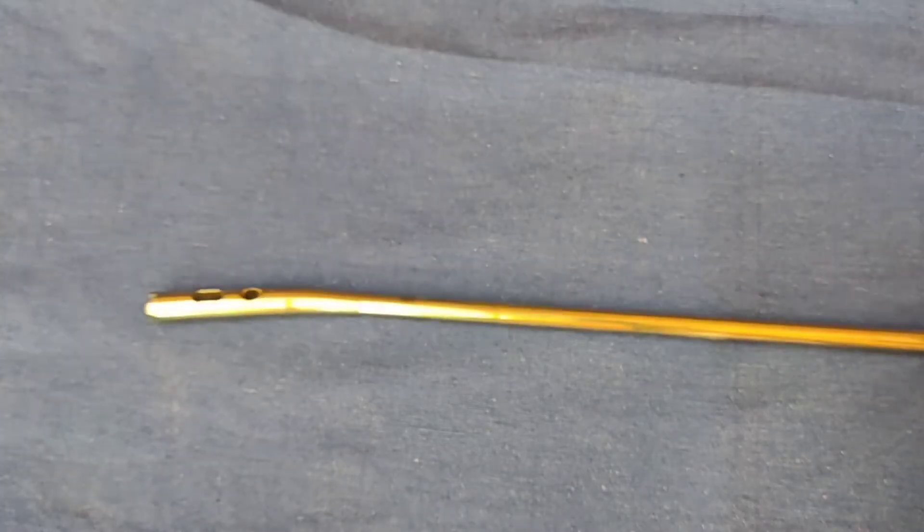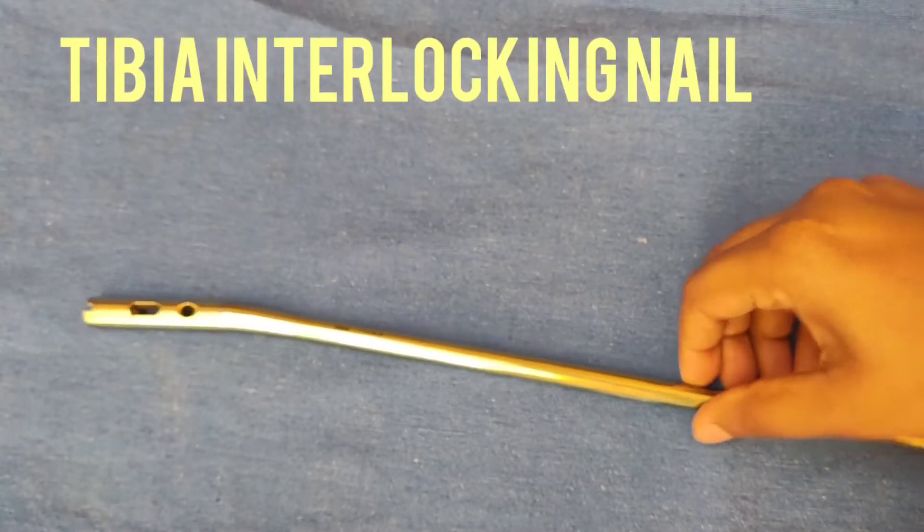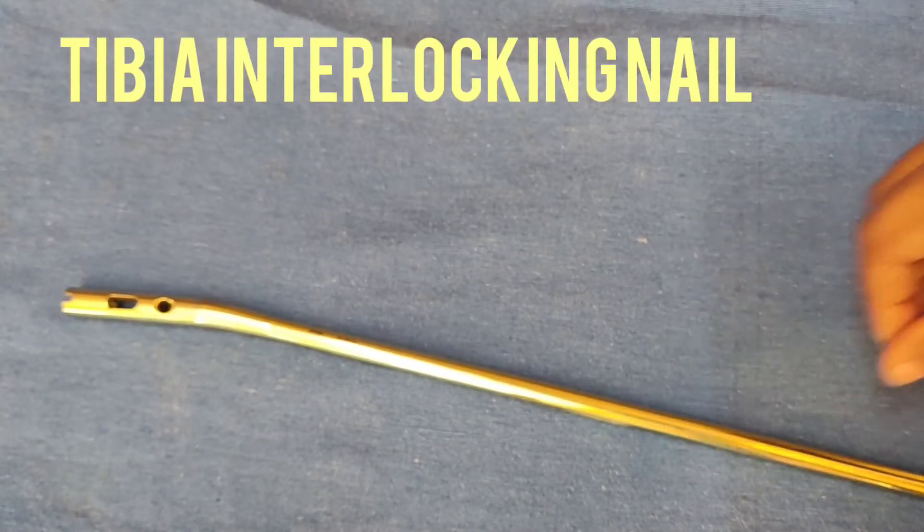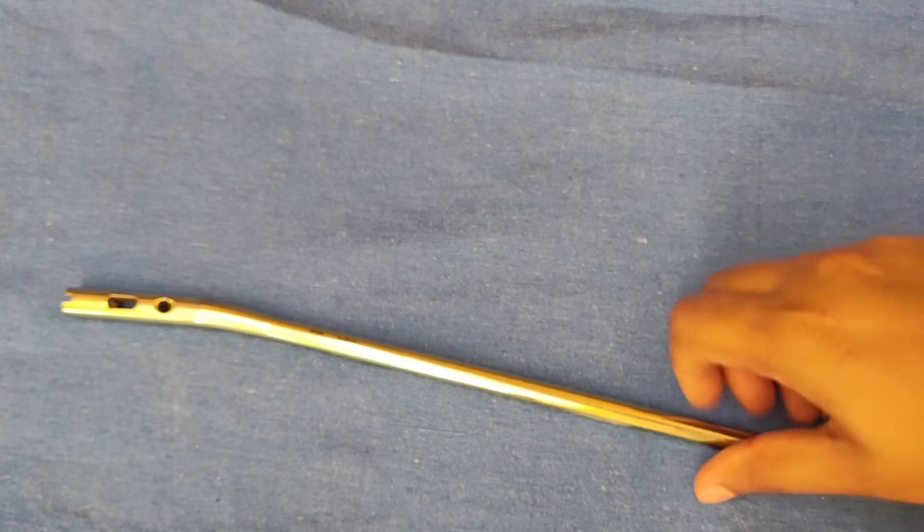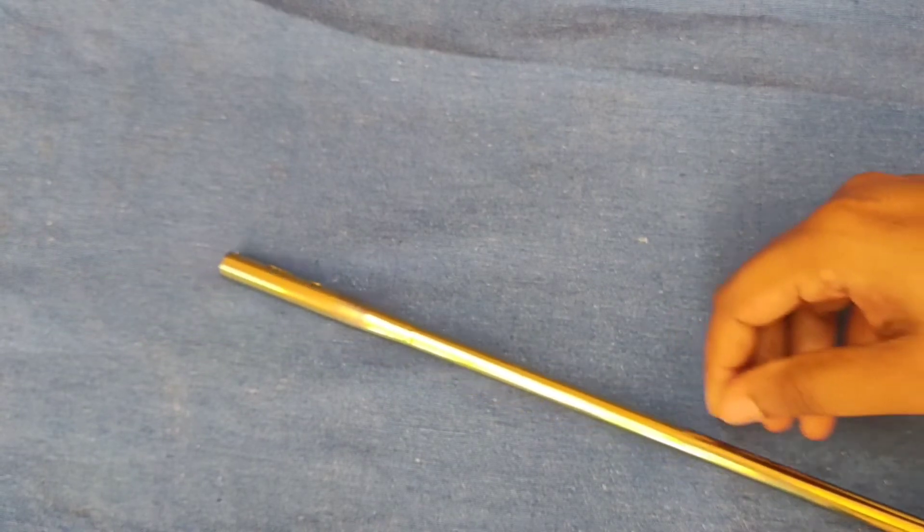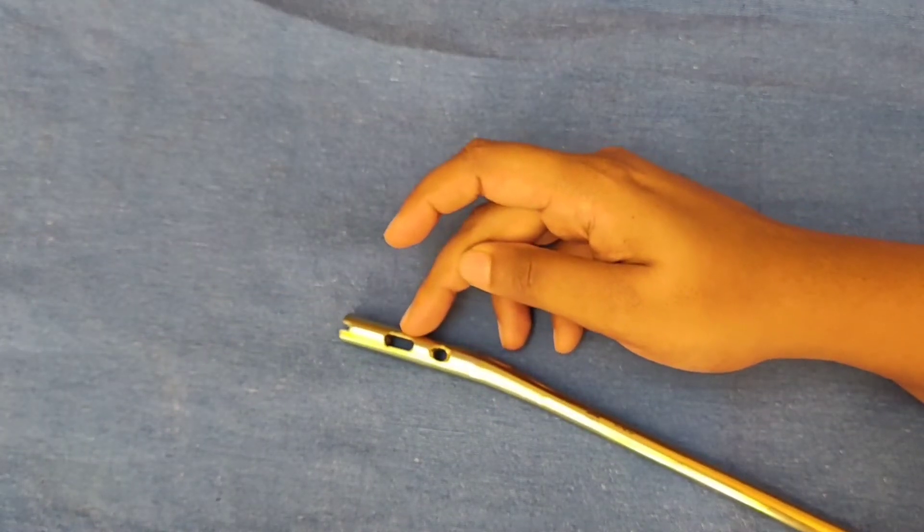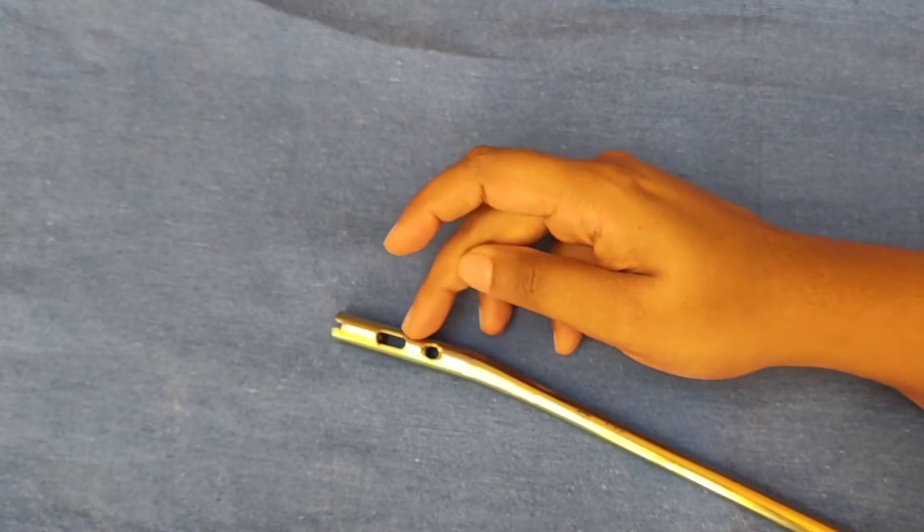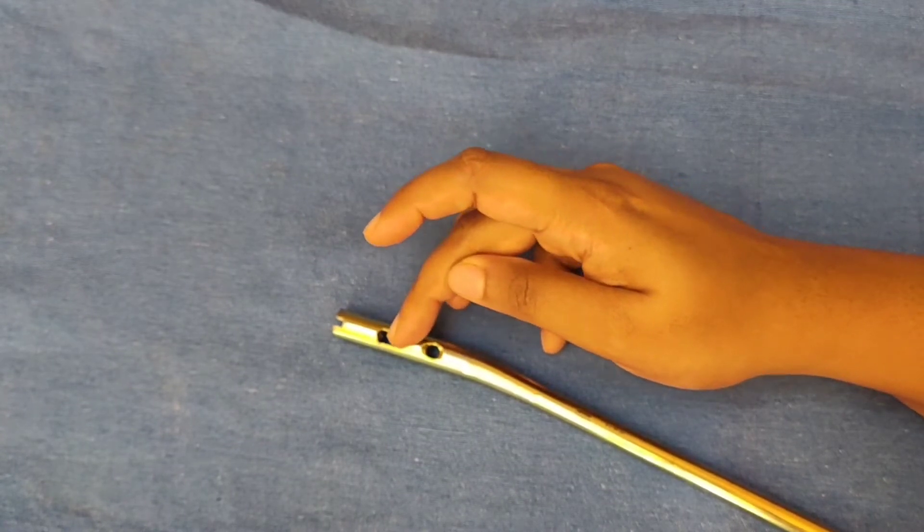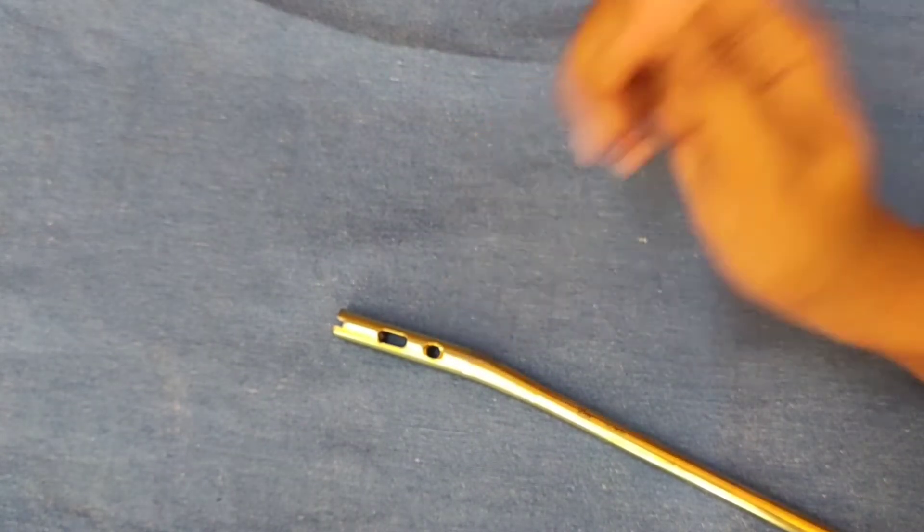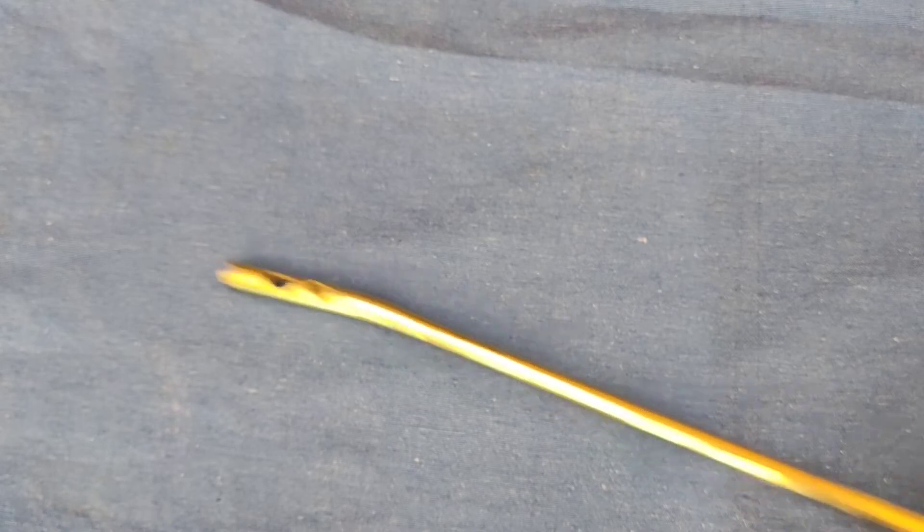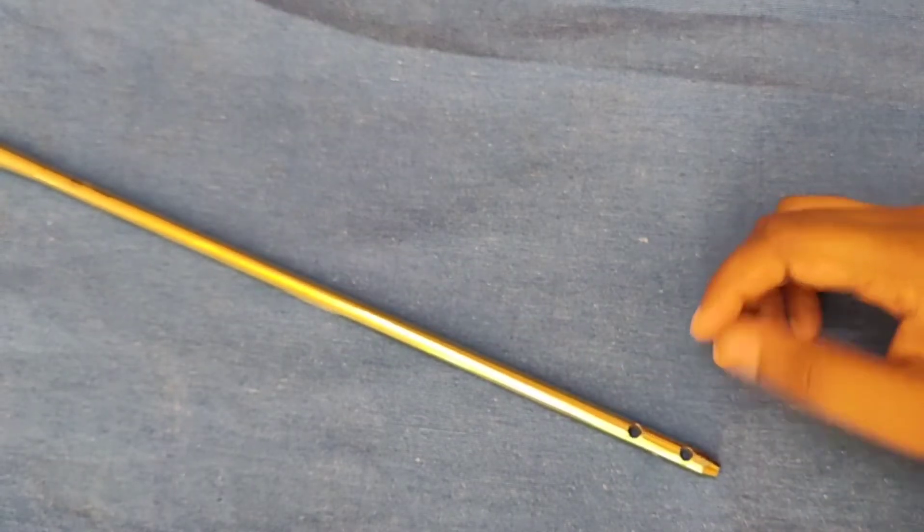Next is interlocking nail for tibia. So interlocking nail for tibia: the proximal end you can see there is a dynamic hole and a static hole. The distal end has anteroposterior and mediolateral holes for screw insertion.